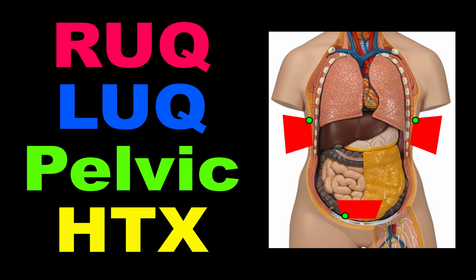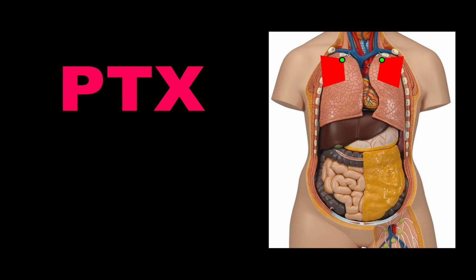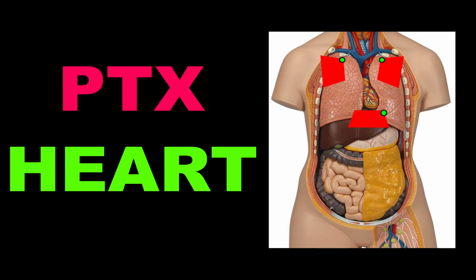Next time, we'll talk a little bit more about the apices of the lungs and finding pneumothorax and other lung pathologies, as well as basic views of looking at the heart to find effusions and cardiac standstill.